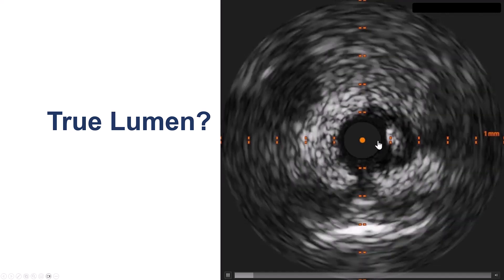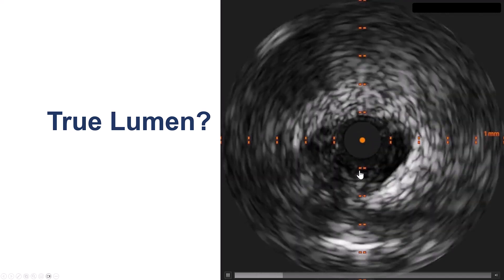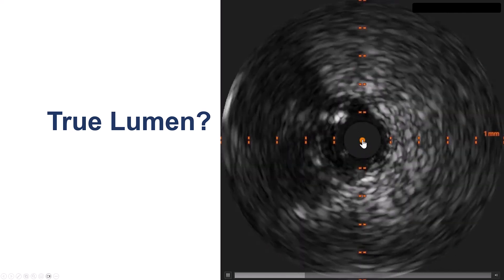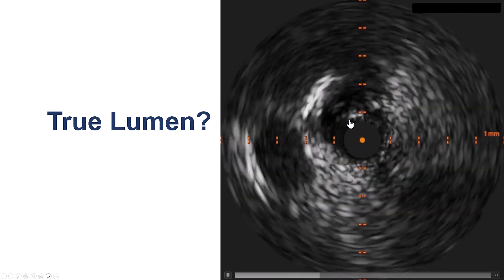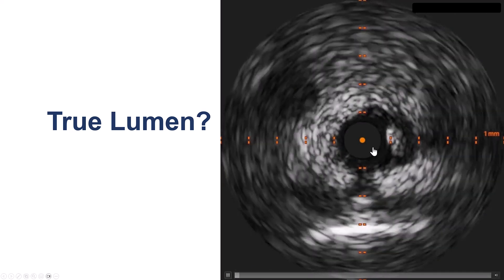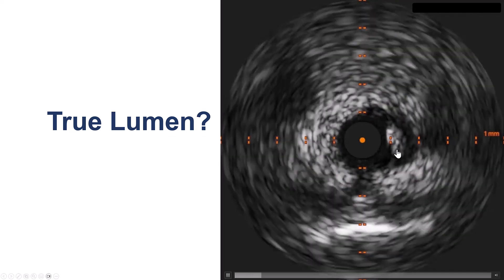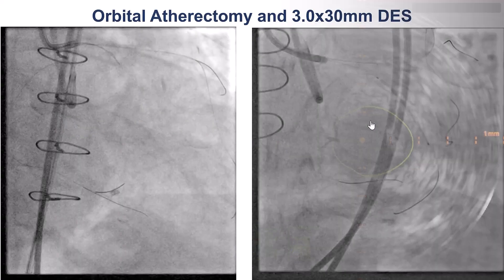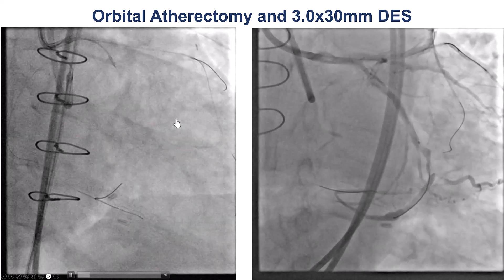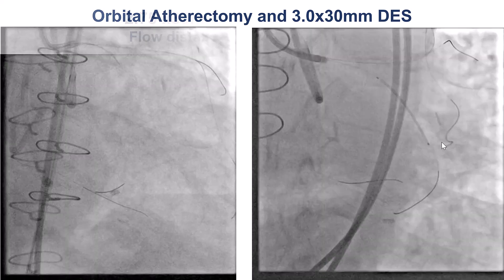So to confirm where we were, we decided to do intravascular ultrasound. This was with the low frequency; we didn't have access at the time to the high frequency IVUS. There was this area on the IVUS, but it was thought that we were intraluminal. We also had disease in the circumflex that we wanted to treat, so we did orbital atherectomy because of the calcium.